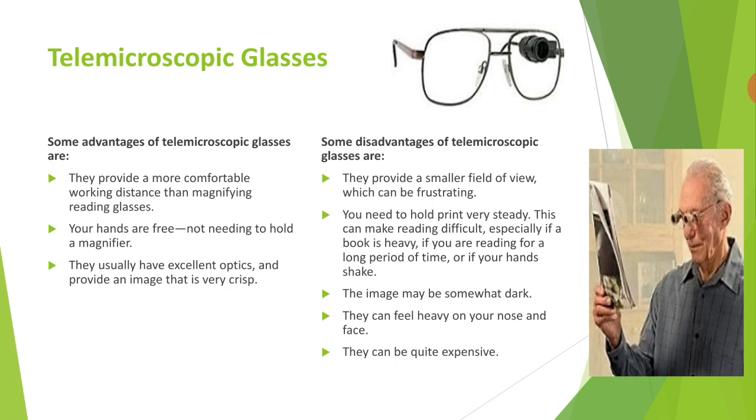So what are the disadvantages of telemicroscopic glasses? One is they provide a smaller field of view, which can be frustrating. So it is frustrating when you use this because your field of view is small. Although you can see far, your field of view is limited.